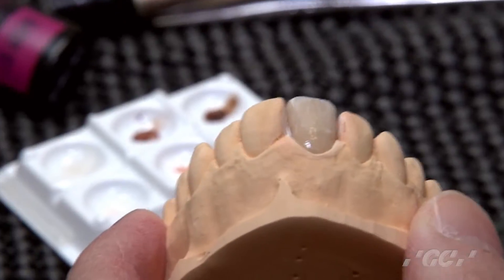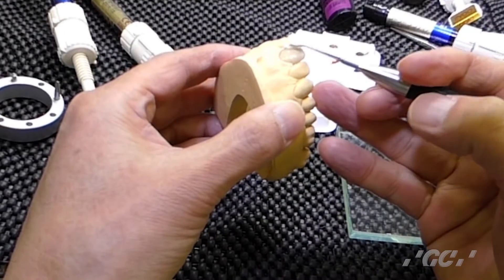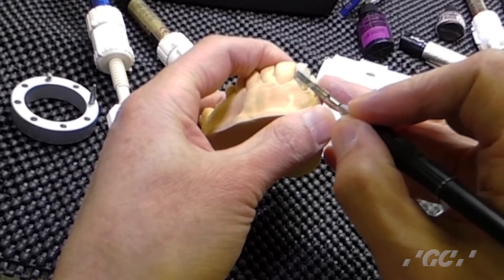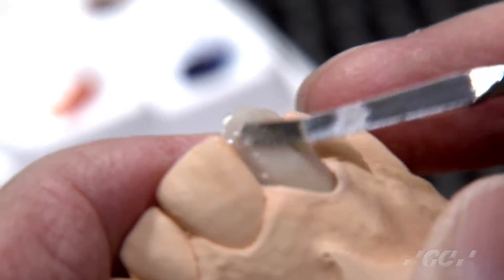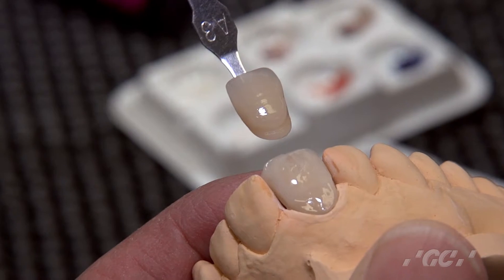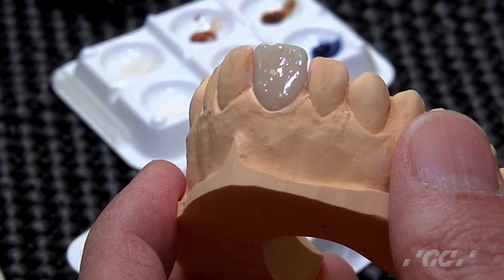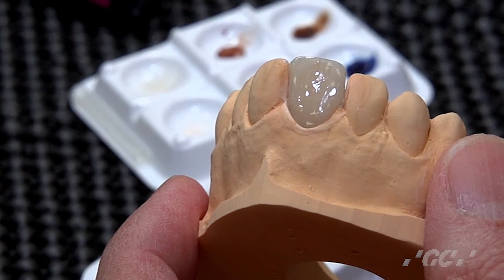So I pick a lighter enamel E1 for the top of the crown. Pick it up — a very thin layer — then make it into a final shape. Enamel you pick, apply it, and make the final shape. As you can see, it automatically comes very close in color to the shade guide. You can see some color internally after applying Enamel E. Then make all shapes and finish the enamel application.